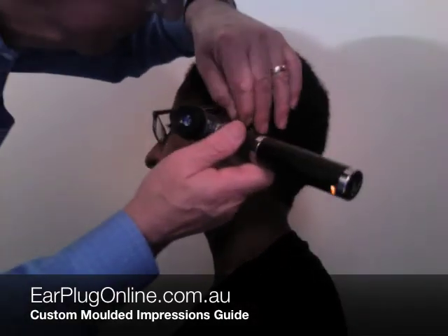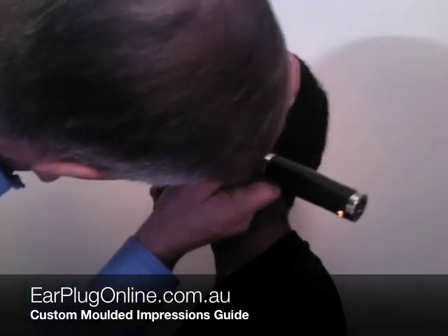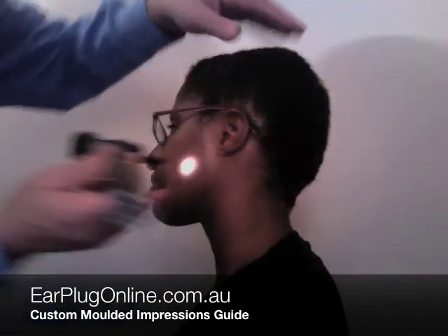A second examination is performed to check that no foreign objects remain in the ear. The impressions are then sent to us for manufacture.